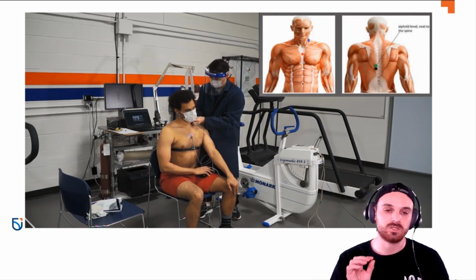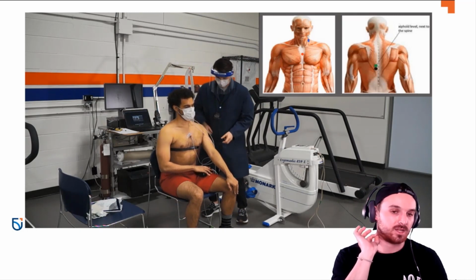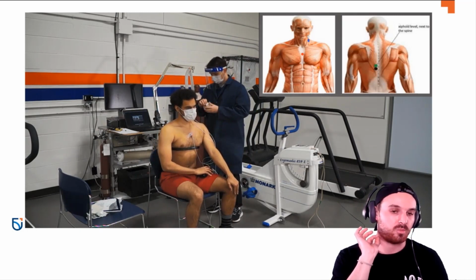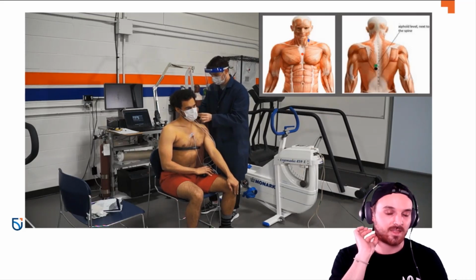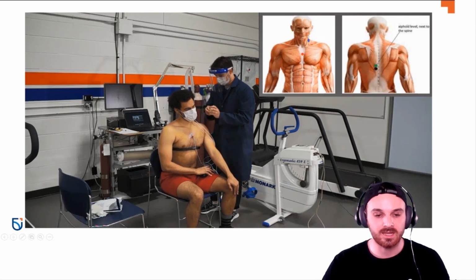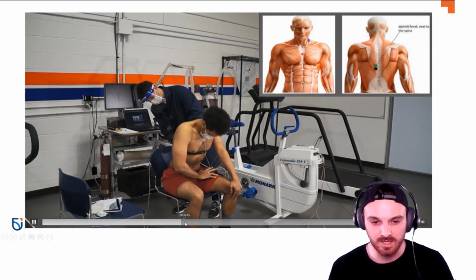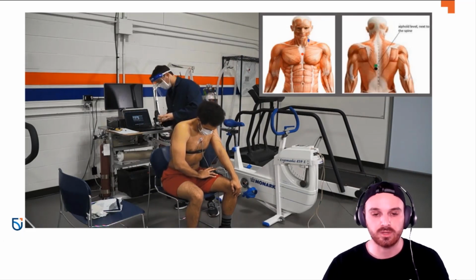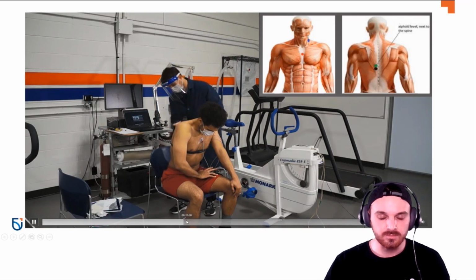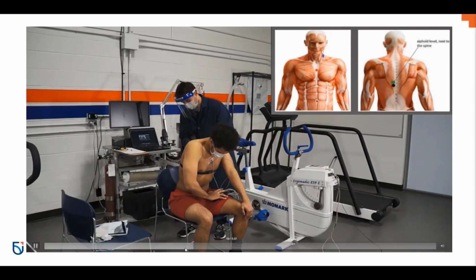Or what you can do, like I was doing here, is, if they have loose enough skin, you can pinch your finger up under it, using that as a backstop without pulling too much on the small little muscles and tendons that are in the neck. Again, taping over all that and making sure that it's prepped. Then handing him the Physioflow to put on as a belt, and then the participant can put their shirt back on. So once I tape the back ones up, I'll pop off here and go full screen.